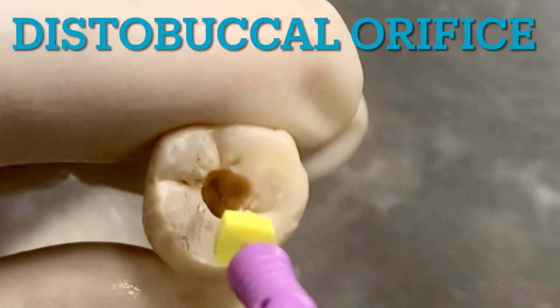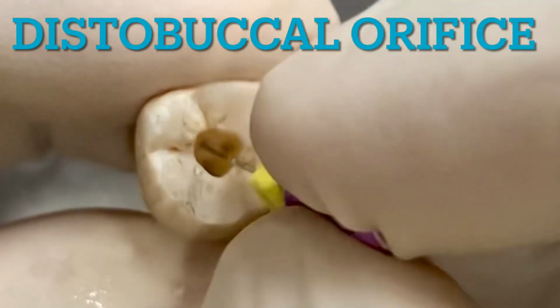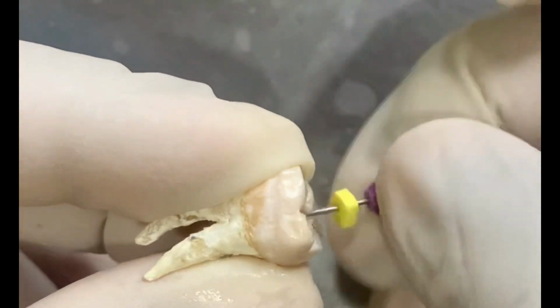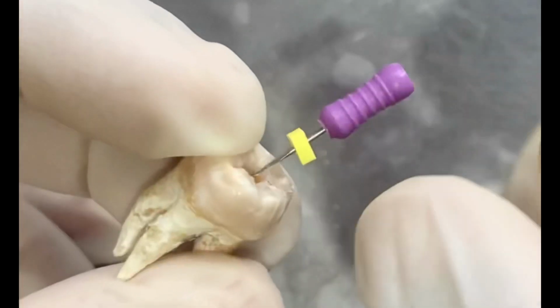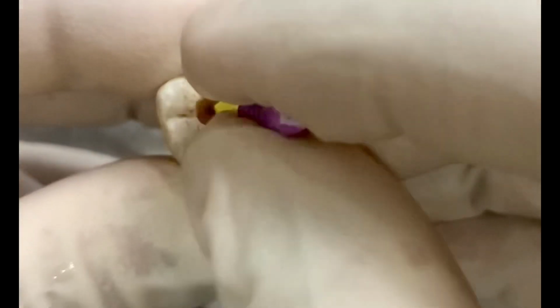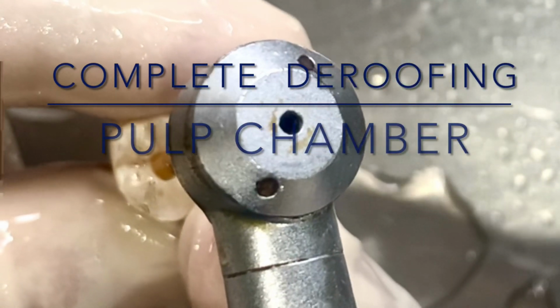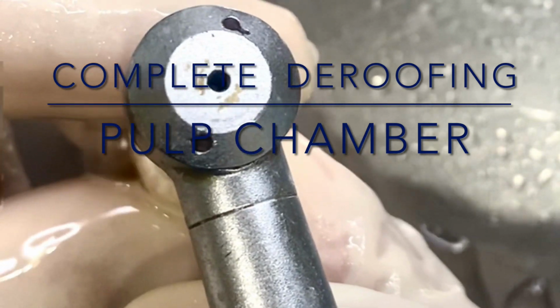Now we'll explore the distobuccal orifice we have entered in the canal. Now in the same way, using gentle to and fro motion, we will move across the file, across the canal till we reach the apex. We have located all the three orifices. Now we will complete the deroofing of the pulp chamber and try and explore for the second mesiobuccal canal.